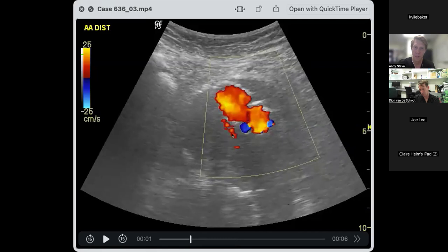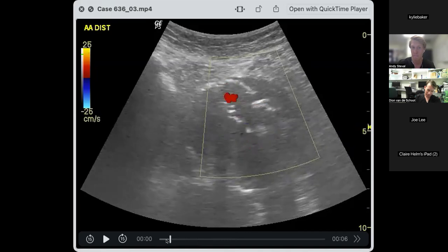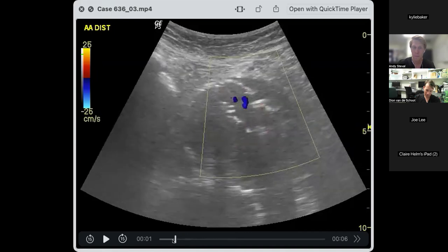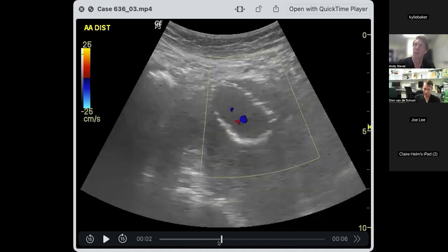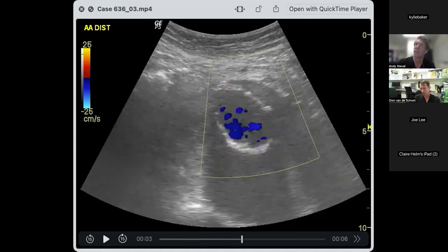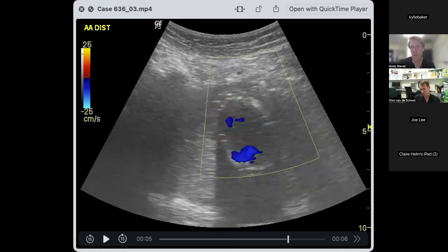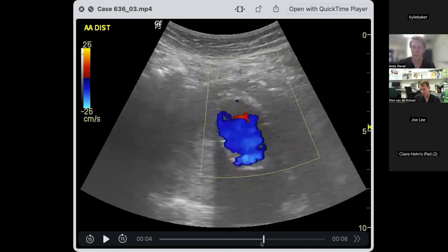Well, there's a bit outside the stent there, so potentially that is significant. Is there anything else that could give you color there other than a leak? I think if you had potentially your gain set too high, you could get color from the wall of the pulsatility, creating artifact, causing flow. Yeah. So there's actually a few artifacts.